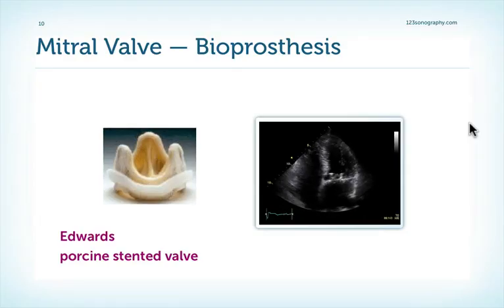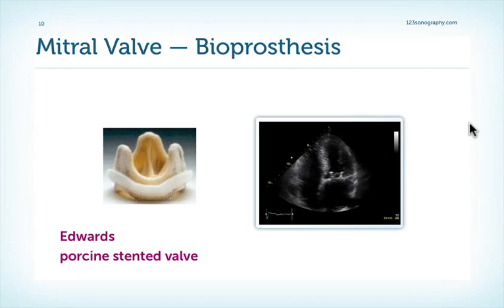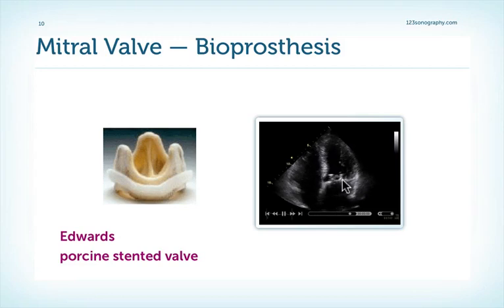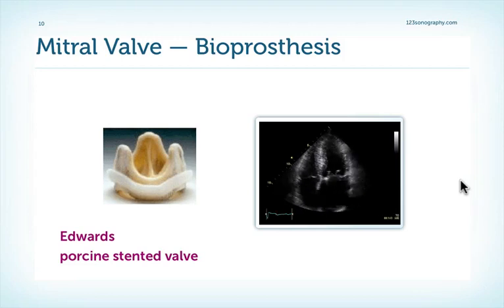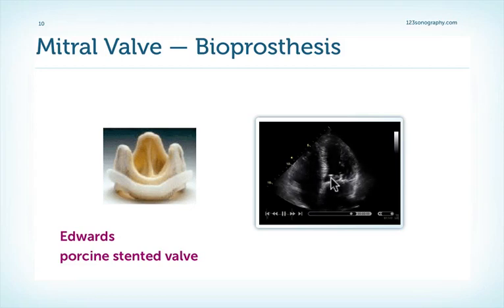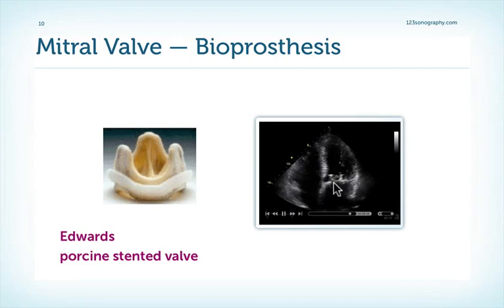Here is another prosthetic mitral valve — however, this time not a mechanical but a biological valve. This is a stented valve. You can see one strut here, and another strut here; the third strut is out of the field of view or out of plane, so we do not see it. We see that there is tissue in between these two struts. Note that the struts protrude into the left ventricle, and also that we do not see any shadowing of the left atrium.